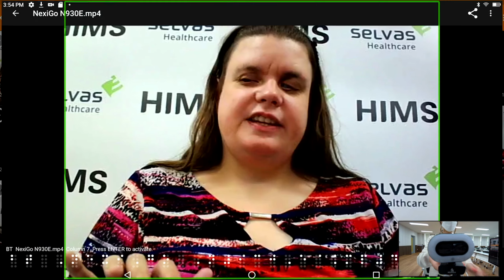And like I said, it's just tiny. This can really easily fit in your side pocket or a zipper pocket of a carrying case or something like that. So that's its advantage, and of course also its price. I've seen this for around like $31. It's actually even cheaper than the N660, but it's quite a bit better for that price. So again, this is the Logitech C270.